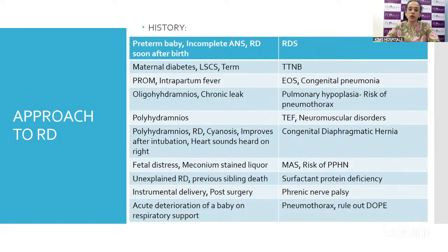And lung ultrasound is also an upcoming modality. There have been a number of studies comparing X-rays with lung ultrasound so that the radiological exposure can be minimized in neonates. Since the chest X-ray is the basic one which is available in all centers, we should have a good understanding of the chest X-ray. Followed by that, we should also try to learn lung ultrasound and deliver the appropriate care for the neonates.